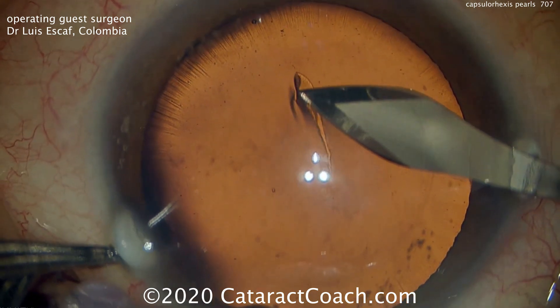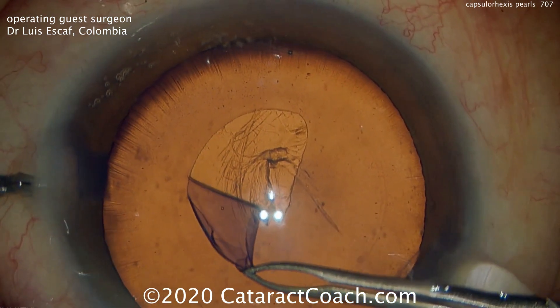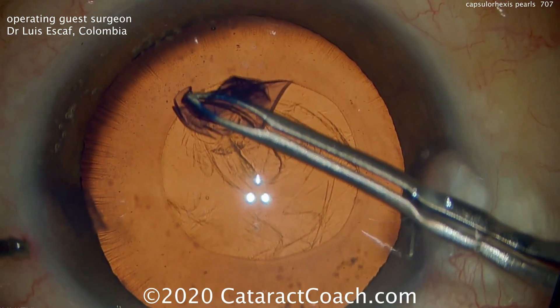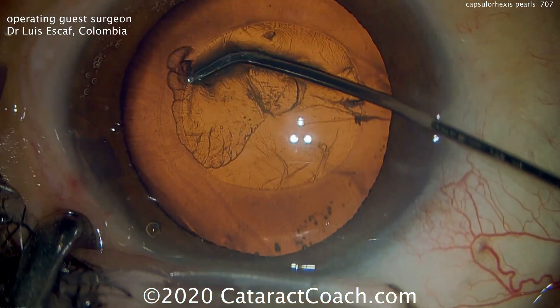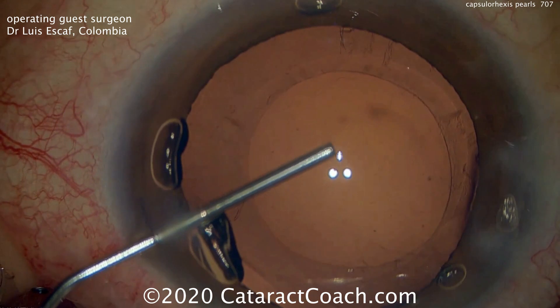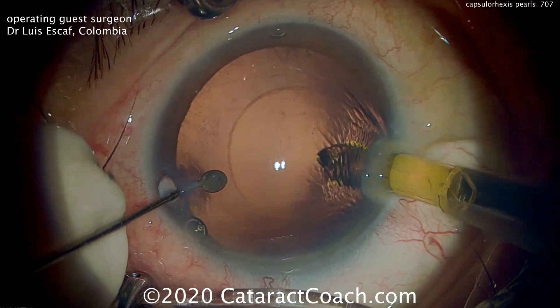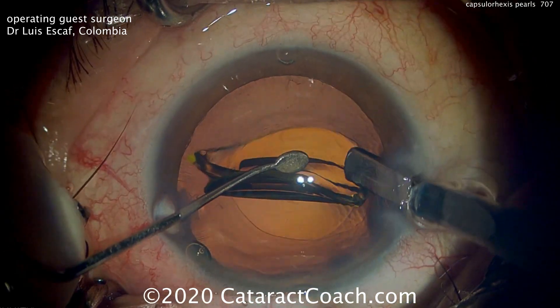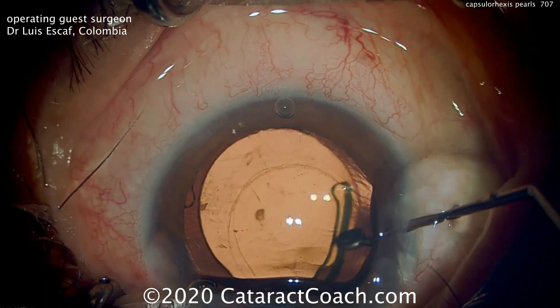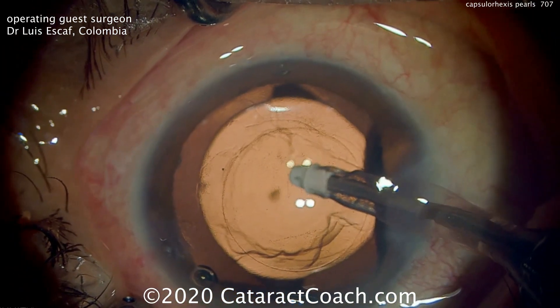This is a technique that may require some practice to master. Now that flap can be lifted up, and forceps grabbing the capsule edge allow a nice capsulorhexis to be performed. The capsulorhexis is a very integral part of any cataract surgery — it's one of the most critical steps. These are a couple of pearls that can help you become more efficient as well as more precise. If you're using that ring, you don't need marks on your forcep tips. Be careful not to push too hard, as you may cause a corneal epithelial abrasion. Remember not to use the pupil margin as your guide when making a capsulorhexis, because with very large dilation you may inadvertently make too big of a capsulorhexis.